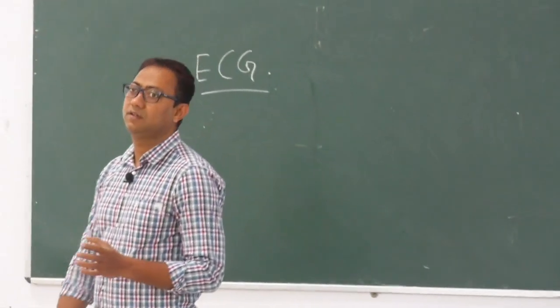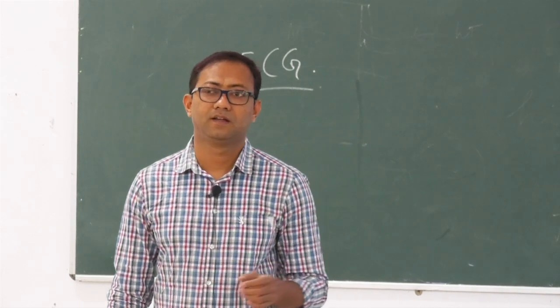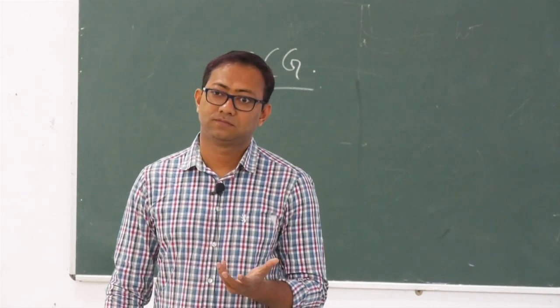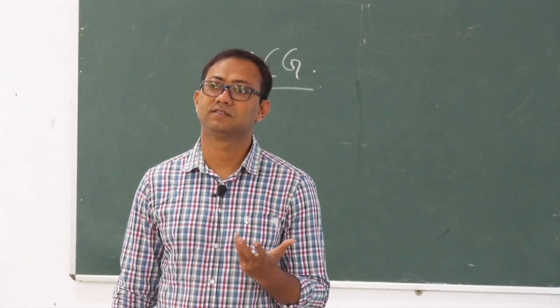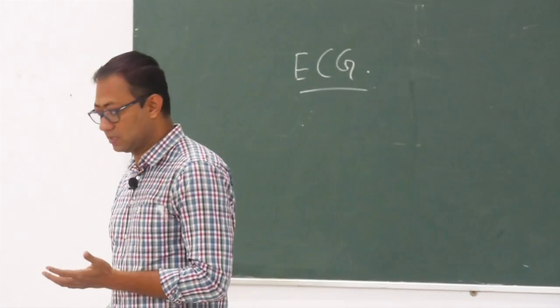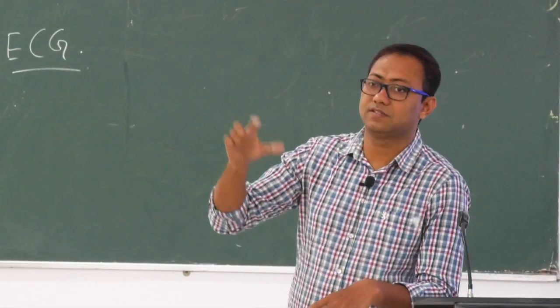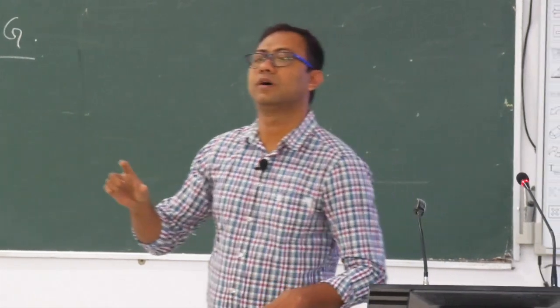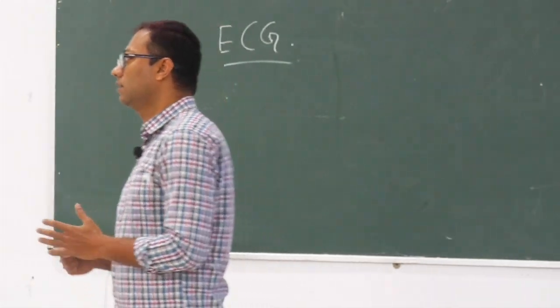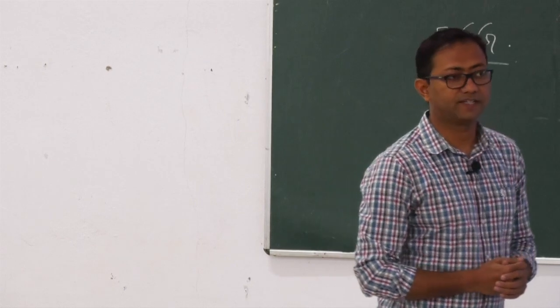So, what is the purpose of that machine, electrocardiograph? It measures what? It measures the electrical activity of the heart, right? Because ECG is your practical topic, you need some background knowledge before directly performing ECG for a patient, or a healthy individual, right?